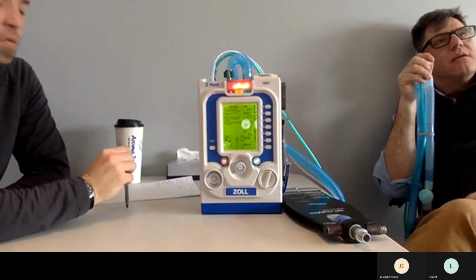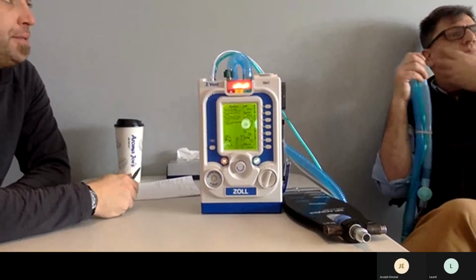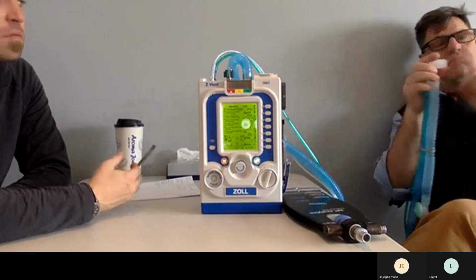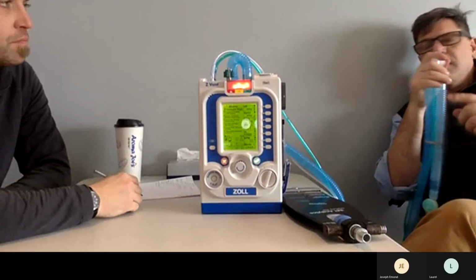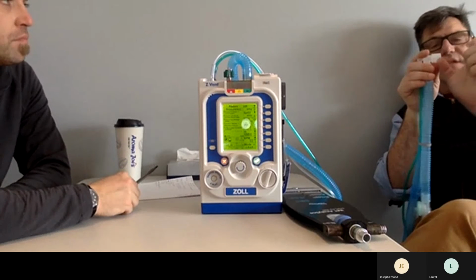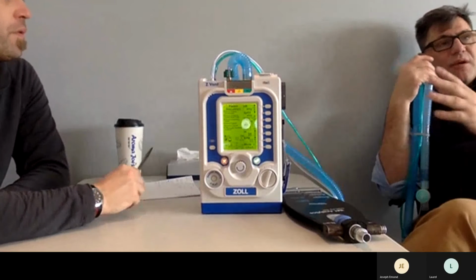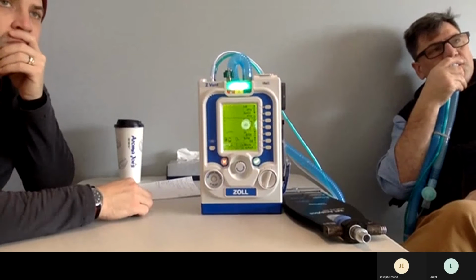So it would help with the guys that have the full facial hair and all that. Take a large Tegaderm, old school, and put that on there. Instead of the cannula one, with the mask you can put that ET tube one in line, right? Isn't that going to give us a better reading with less worry about leak? Some people put the mask on and then put the ETCO2 in there, so you have to put the ET tube one on the inside of the mask, so it sits more in the mouth. Just ideas. You're just replacing the tube with a mask in line, that's all.